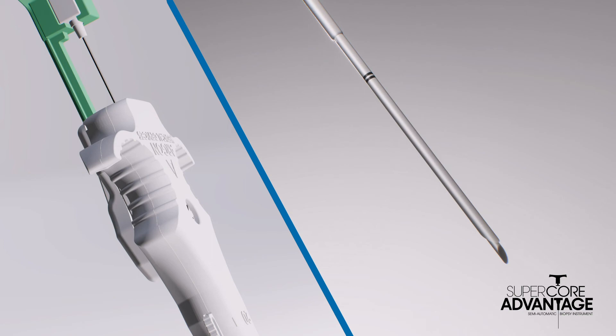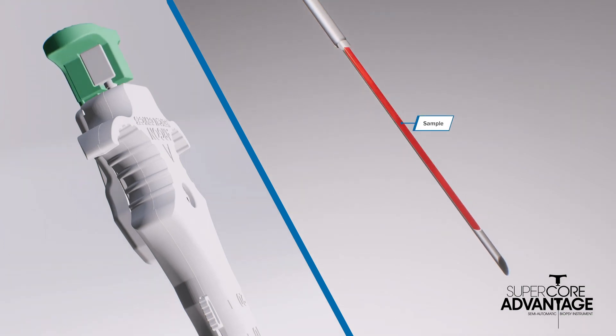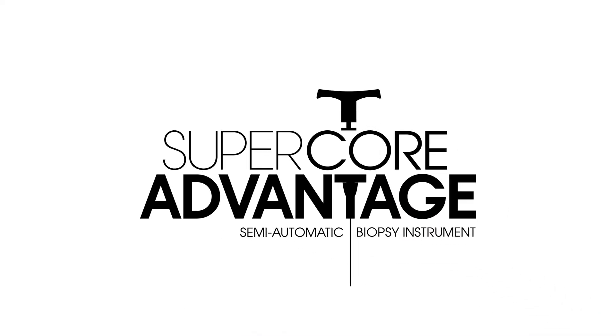To reveal the harvested sample, pull back the rear plunger, then advance the stylet forward by pushing on the rear plunger. The sample is now ready to be removed.